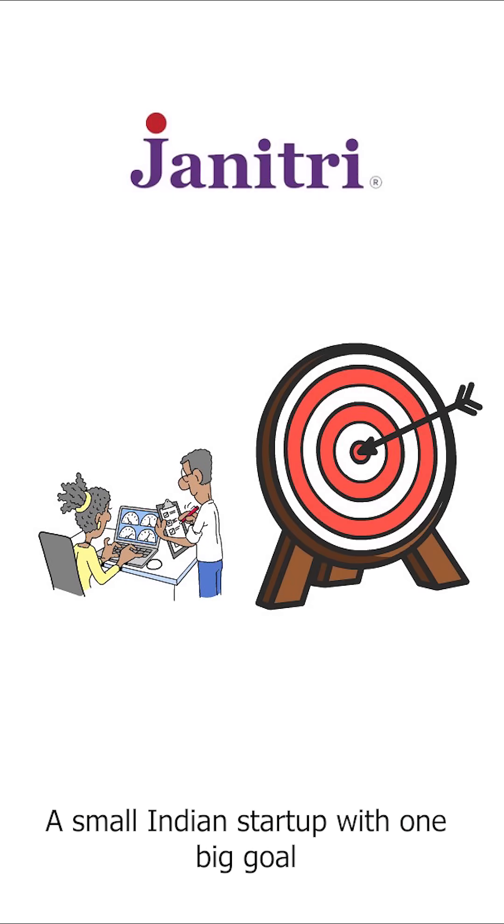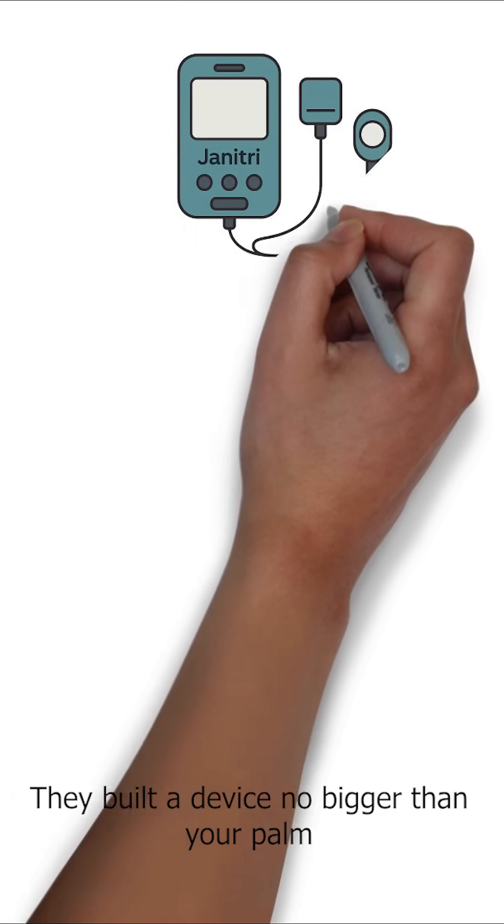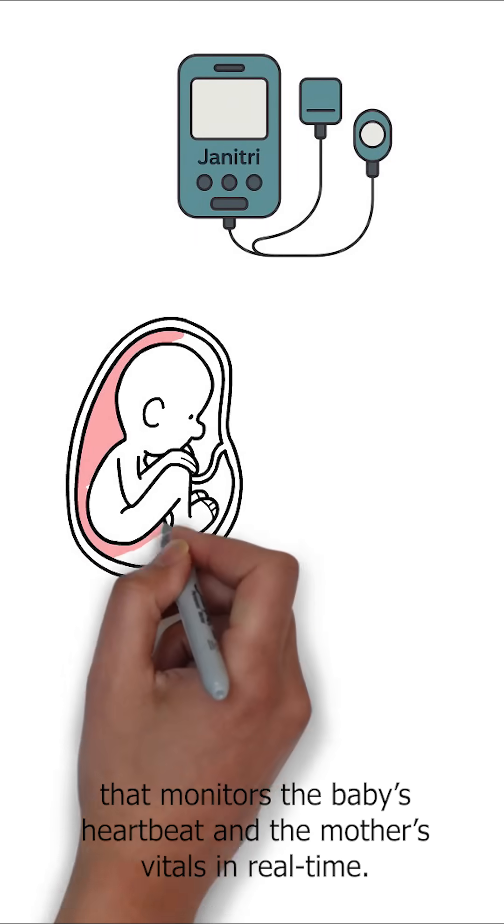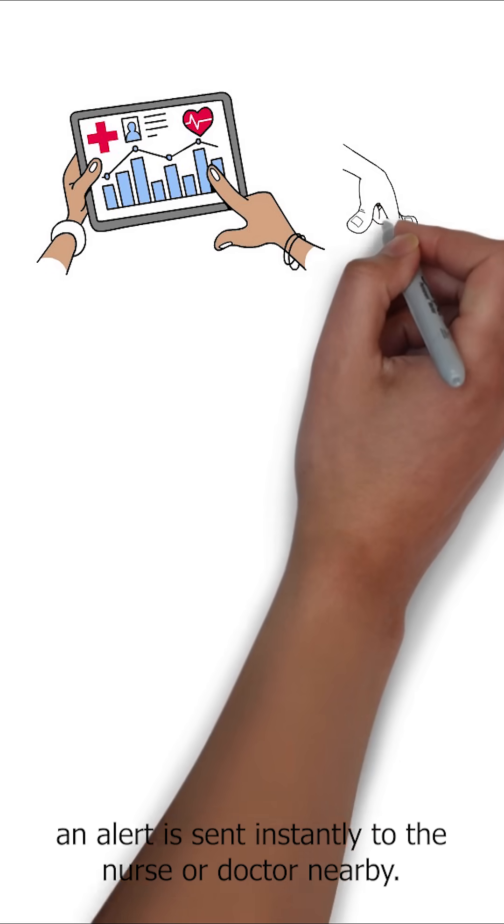Make childbirth safer for every mother everywhere. They built a device no bigger than your palm that monitors the baby's heartbeat and the mother's vitals in real time. When something goes wrong, an alert is sent instantly to the nurse or doctor nearby.